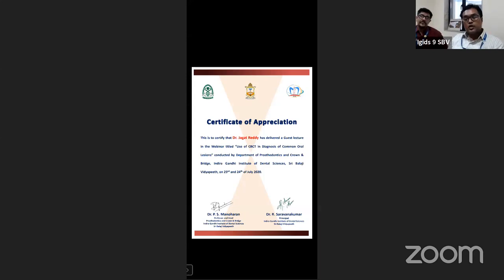Another interesting thing is we do not use Hounsfield units to describe densities like in a conventional CT. Here we have an equivalent of Hounsfield units, and in most of the software, when you run the cursor through the bone, it will start giving you numbers, plus and minus. Minus being air and plus being dense bone. Based on those numbers, and looking at the cortical anatomy, you will know whether it's D1, D2, D3 or D4.